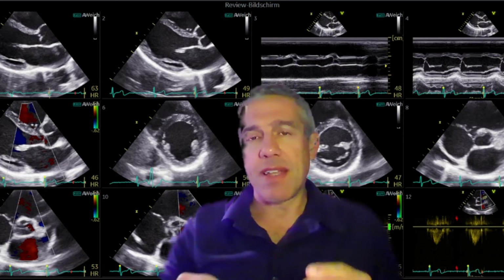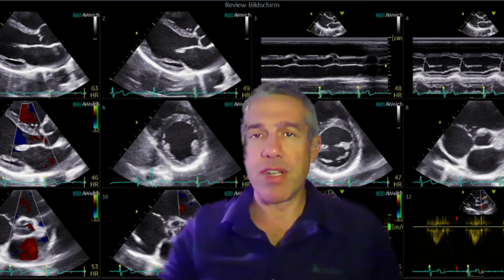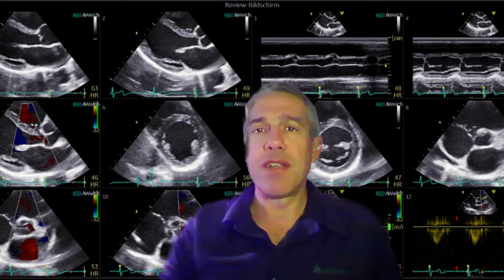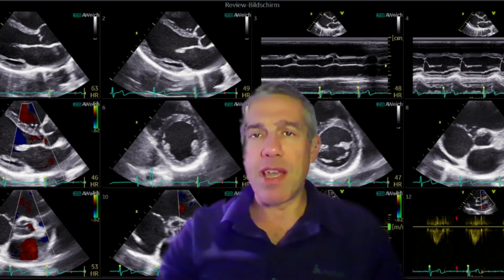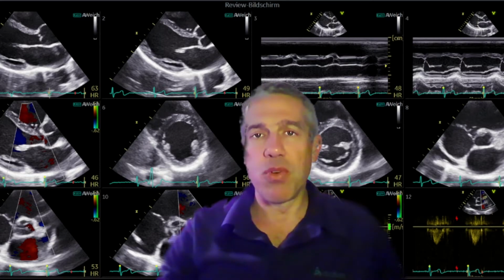And then we scanned him at different VV delay settings, so interventricular delay settings between the right and the left electrode, and with standard right ventricular pacing. And we will compare the different contraction patterns as we can analyze them by 2D strain imaging. We will only focus on the apical four-chamber view, and this will tell us the whole story, which is important.